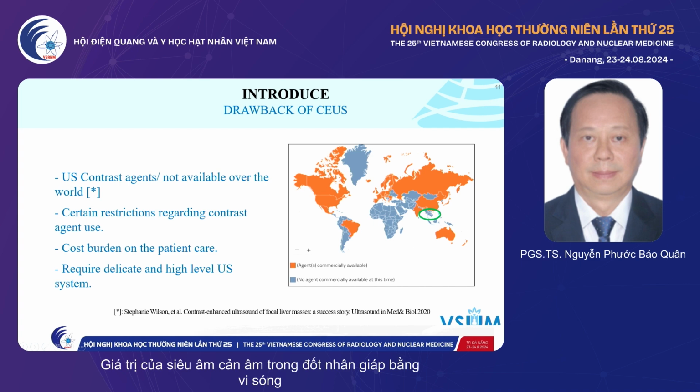But CEUS has disadvantages. You can see CEUS is not available all over the world. In Vietnam, we still have no contrast agent for daily practice. Another drawback of CEUS is a certain restriction regarding contrast agent use, particularly the cost burden on patient care. You can see the price of CEUS is very high compared to other contrast agents.